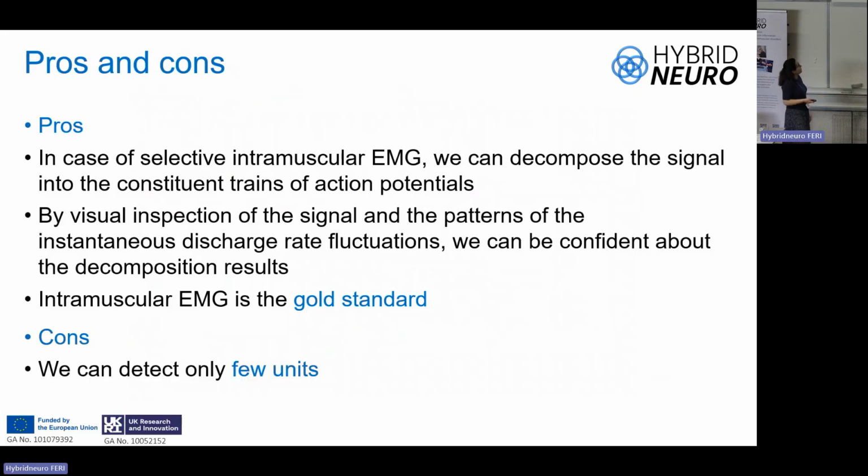Because the electrode is very selective, you can detect the activity of few units only. And this limitation somehow motivated the development of new technology, which I will discuss in the next session.